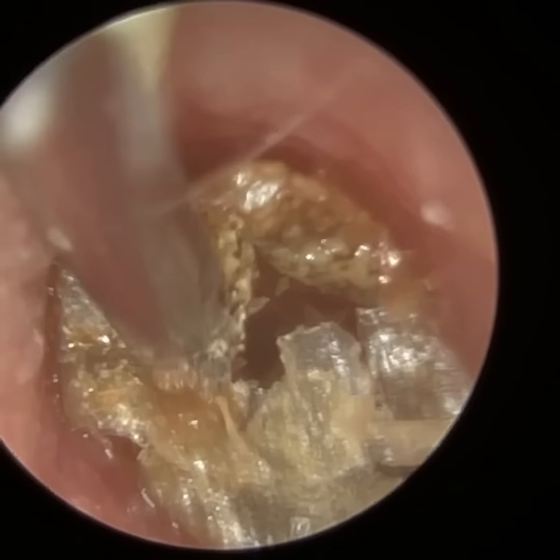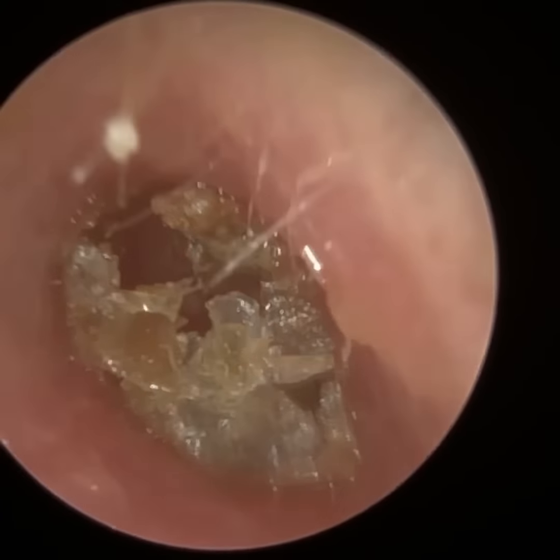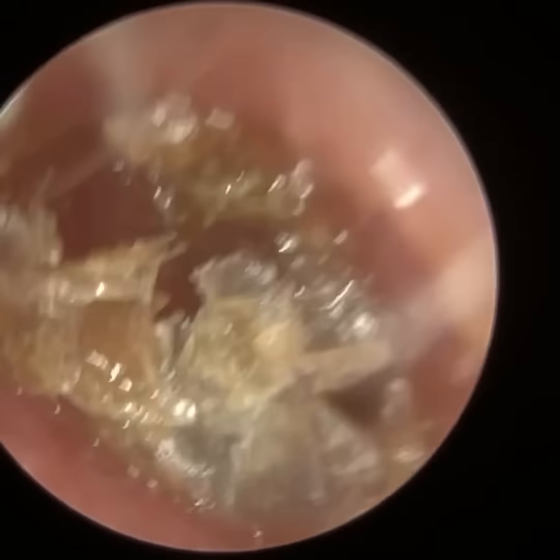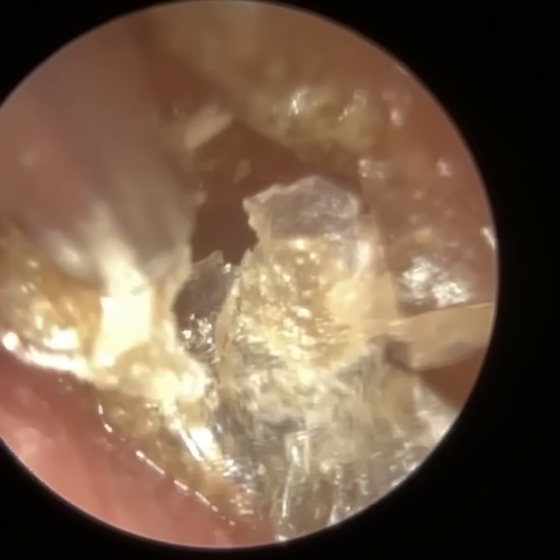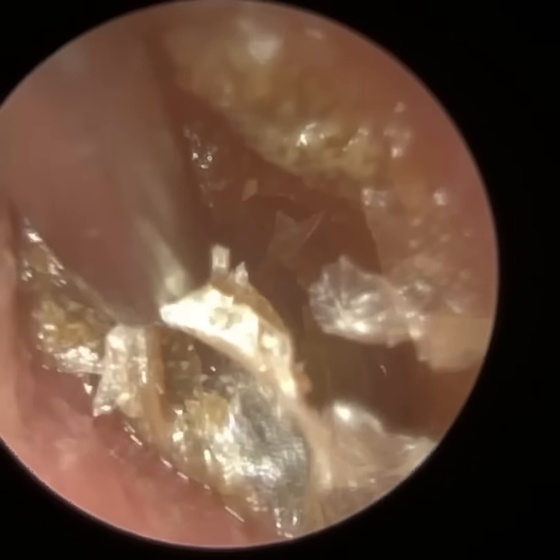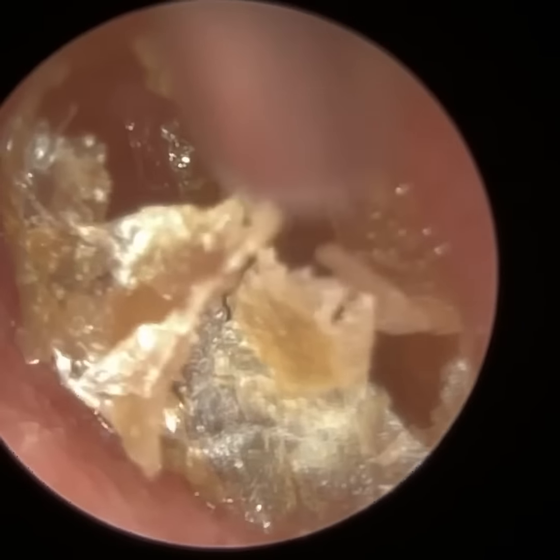Upon attending today, you can see there's this crusted dead skin lining his medial ear canal and also adhered to his eardrum. There were a few fungal spores there as well, so I said I'll remove it for him at no cost.